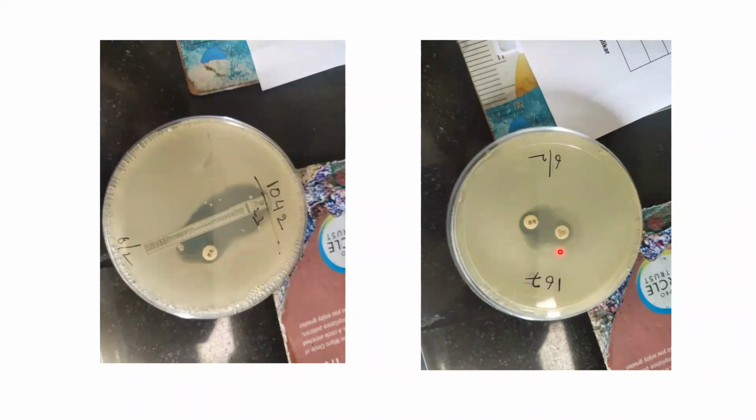Same thing, if you use meropenem with aztreonam, you will not find any synergy. The reason why this was chosen is because we know the background, how these antibiotics work, and what synergism is likely to help. We put together two drugs with different mechanisms of action and test that with this test. Meropenem with aztreonam won't work because there is nothing that will neutralize the carbapenemase production which that given bacteria may have. A microbiologist possesses this information, and that is how he or she is able to choose this. So this is not done as per a physician request, is what I'm trying to understand.